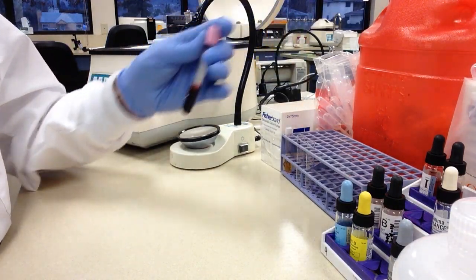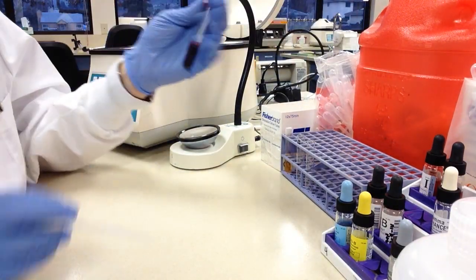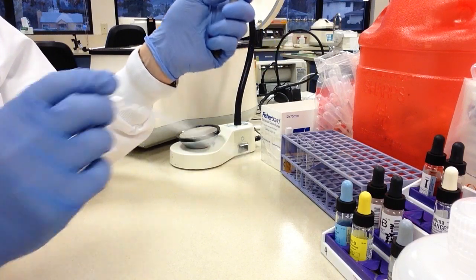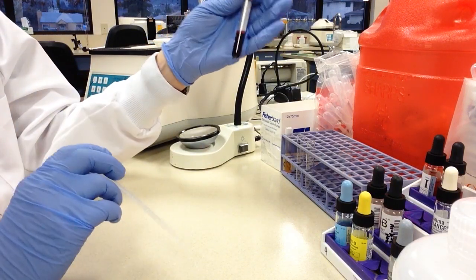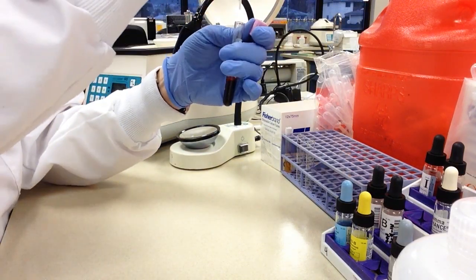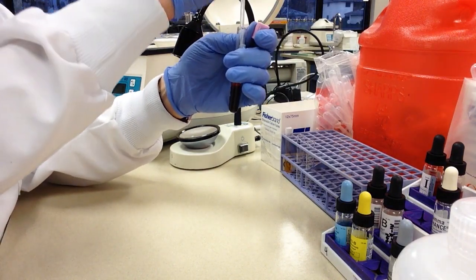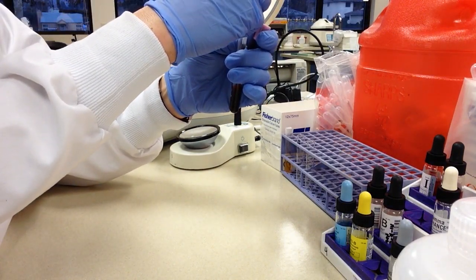Alright so from our EDTA tube we're going to have to draw a little bit of those cells out on the bottom. So just take a disposable blood bank tube and there's no exact amount we need to measure just suck a little bit up. We're going to need about 3 drops.